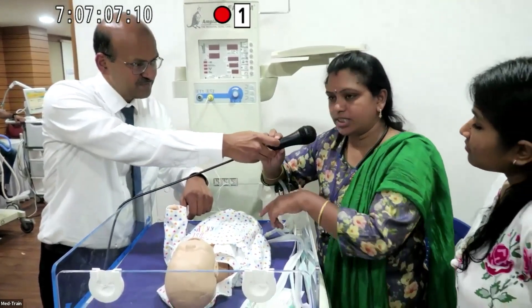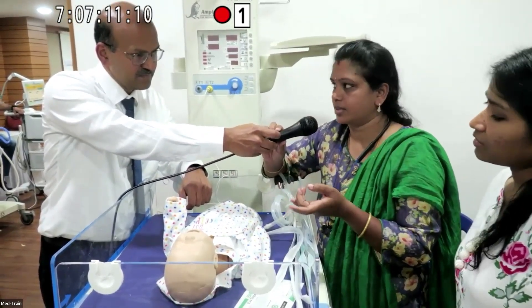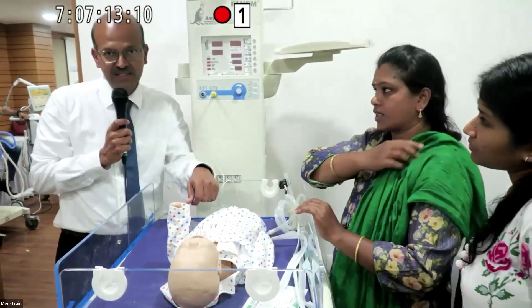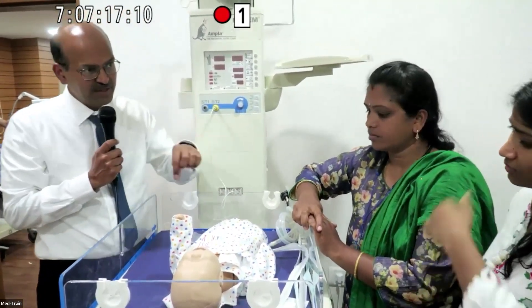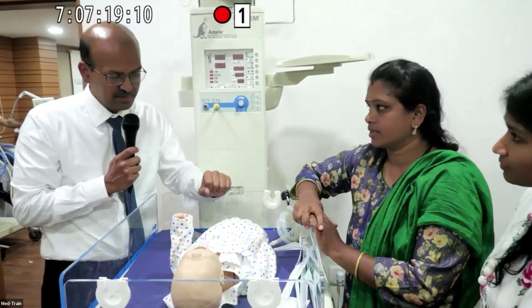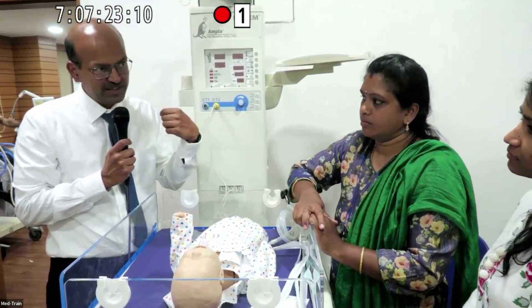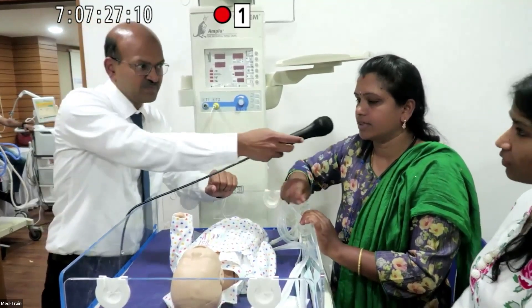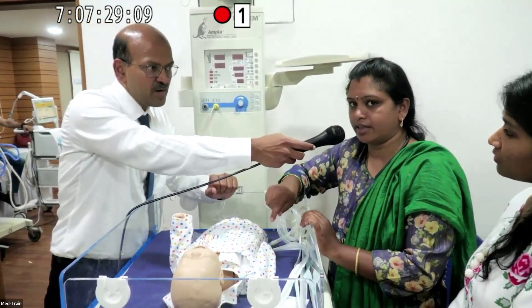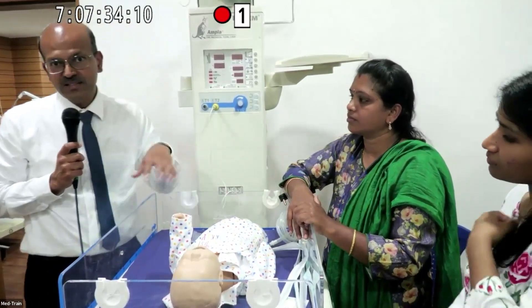Each time you suction, use a different catheter. The exception is inline suctioning, which is a closed system — the catheter is kept in a sealed sheath. With inline suctioning, ensure the catheter is pulled back to the right level after use, as leaving it in causes airway obstruction. The suction valve must be off when connected inline.